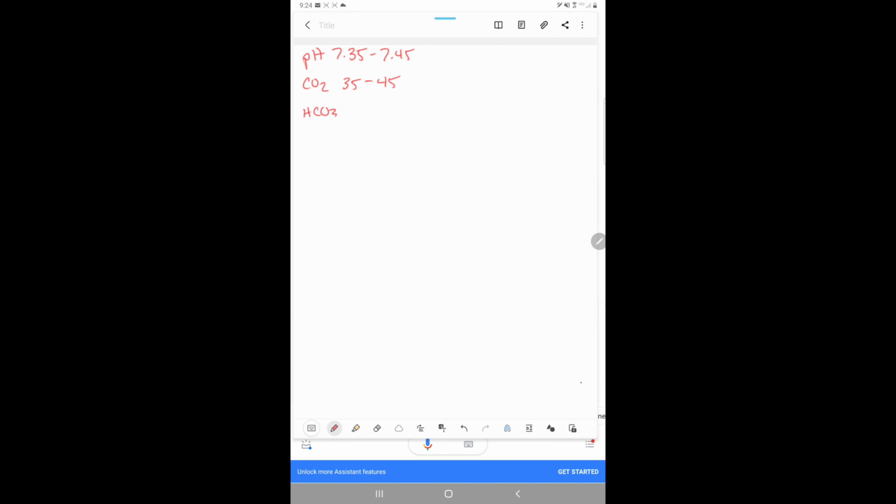Your bicarb is 22 to 26. Okay, and then your PaO2, you have 80 to 100. You have 60 to 79. And then you have 40 to 59. And then you have less than 40.